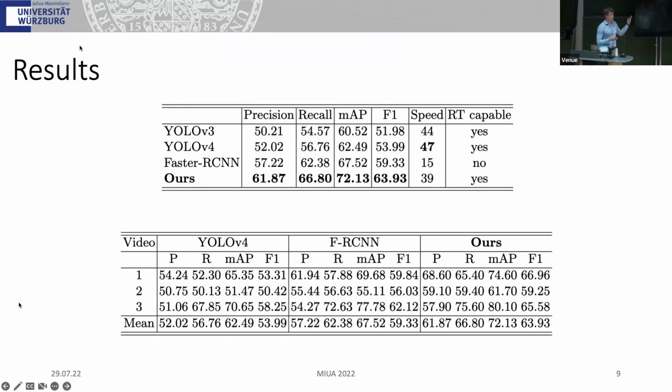You could improve them to around 90% or something, but still, with the low resolution and the camera sizing, and the point that the cameras are mostly on walls, it's way harder than doing polyp detection on the normal white light view screen.